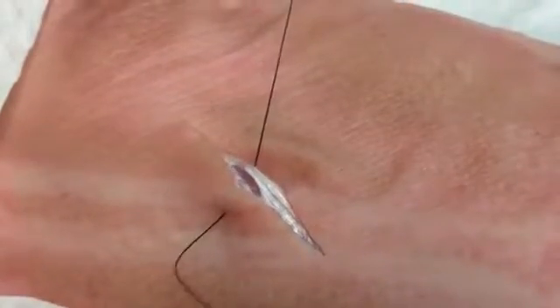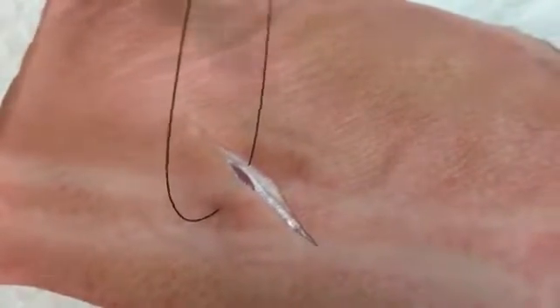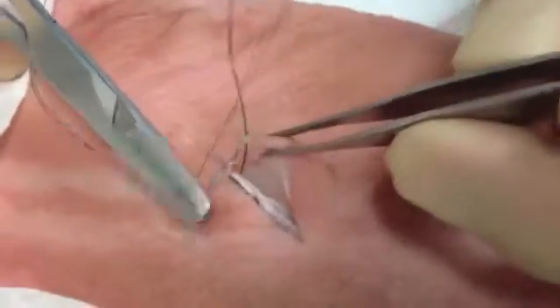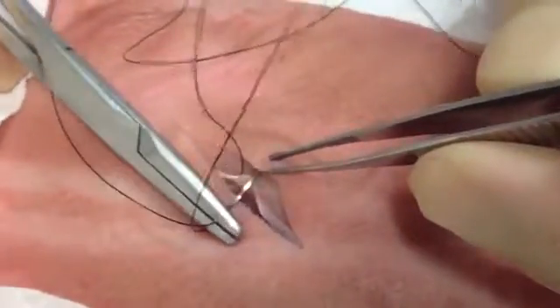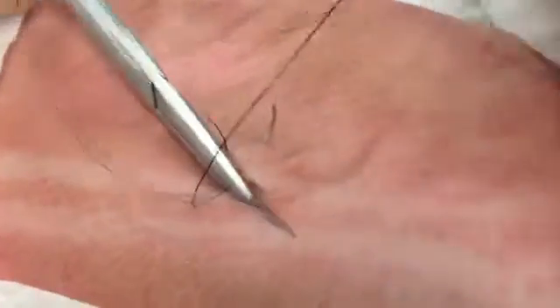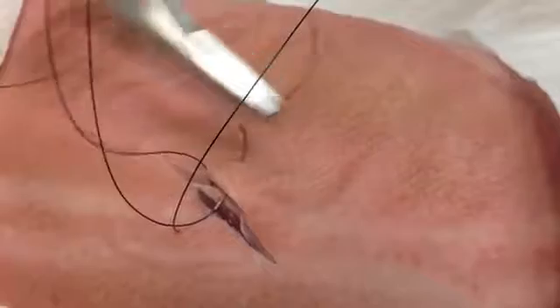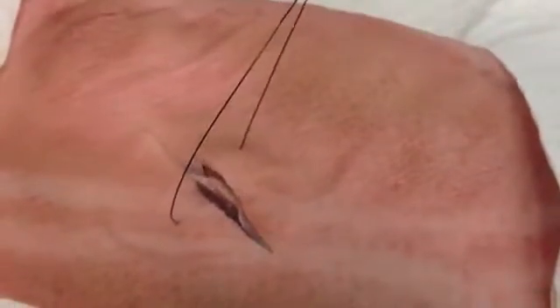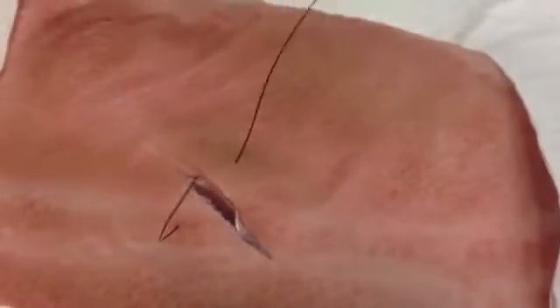We're going to pull our suture through, leaving just a short tail on the far end. And then we're going to, again, retract the opposite end of the wound, take an equal bite on the other side of the wound edge, and we're going to pick up our needle with our pickups or needle driver, being careful not to grab the actual needle point.